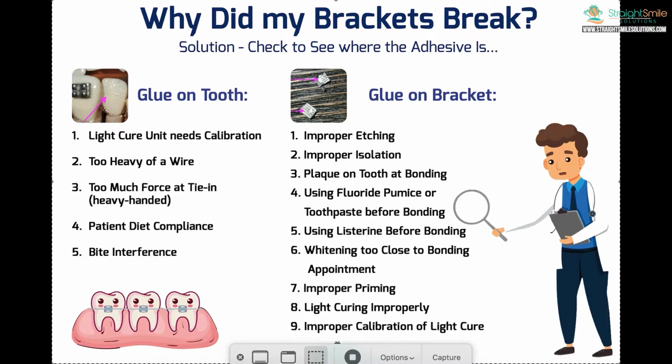Today, I wanted to talk to you about something that's probably a little overdue, but now that I'm starting to get a lot more doctors who are starting to do straight wire since we launched our digital straight wire course, eventually brackets are going to break, right? It's just kind of par for the course. Anytime you do straight wire or braces, kids, adults, sometimes there's going to be random broken brackets. And the occasional one here and there is not a problem. But if it's chronic, it's really going to slow down the treatment and/or completely stall the treatment. You're going to be spinning your wheels.